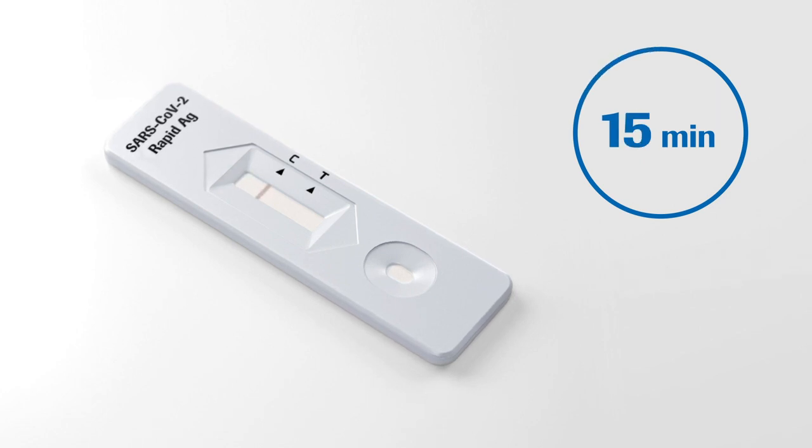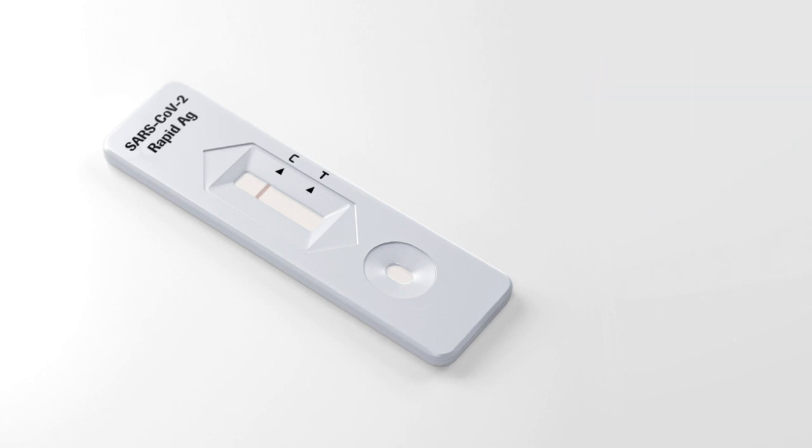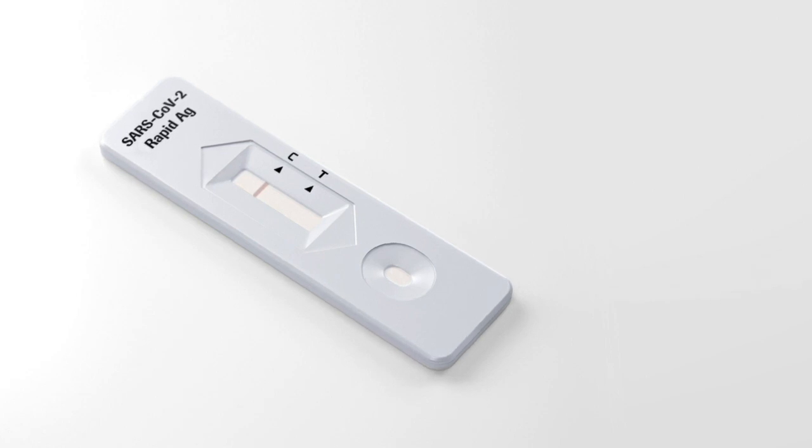In the top section of the result window, a colored line appears to show that the test is working properly. This is the control line C. Even if the control line is faint or not uniform, the test should be considered to be performed properly.